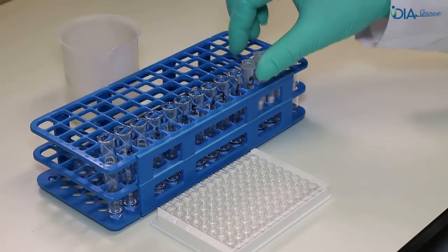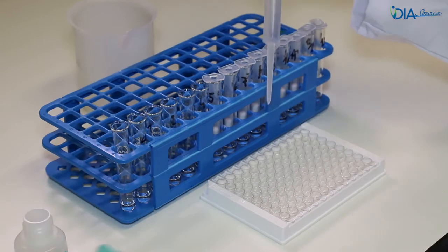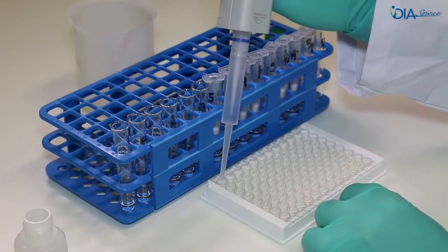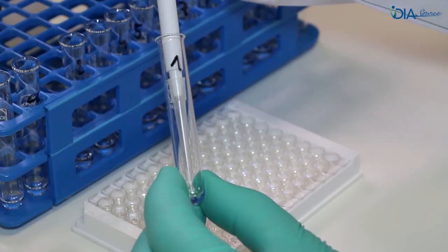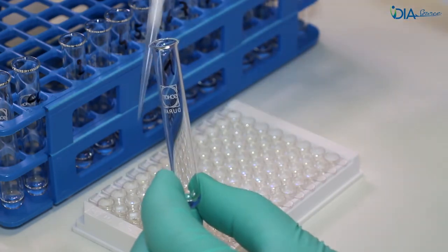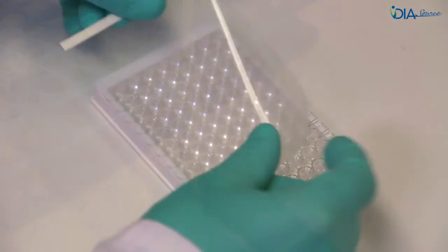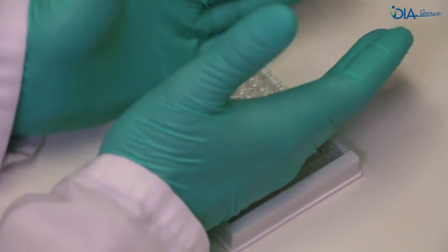Discard the cartridges and vortex the calibrators. Add the incubation buffer into the microplate, then add the calibrators and the eluted 1,25-dihydroxyvitamin D using the pre-saturation technique. Cover the microplate using the appropriate plate adhesive strip and place the microplate into the fridge for the night.